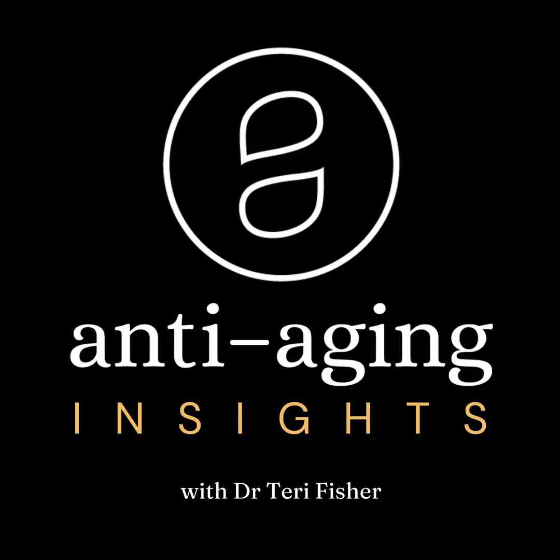Again, we typically use a very fine, short needle, usually 30 gauge. It's less painful for people because they are so small, and it gives me, as the clinician, very precise control about where I need to inject those particular muscles. Just to give you an idea, too, a 30 gauge needle is so tiny, it's really not much bigger than a mosquito bite. That kind of gives you an idea of how small we're talking about when we're talking about a 30 gauge needle.